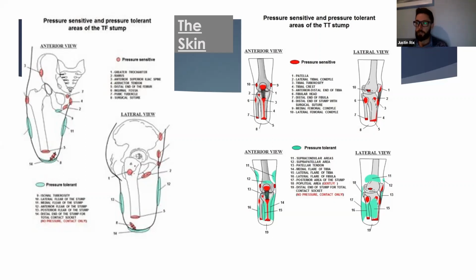So in transfemoral sockets, we generally rely on the ischium as our primary source of weight bearing, along with associated hydrostatic pressure. There are different design methods that have been tried, from plug sockets to quadrilateral sockets, ischial containment, and even ramus containment. We generally use a bony lock with the ischium, and counter pressure comes from the anterior lateral aspect of the socket.